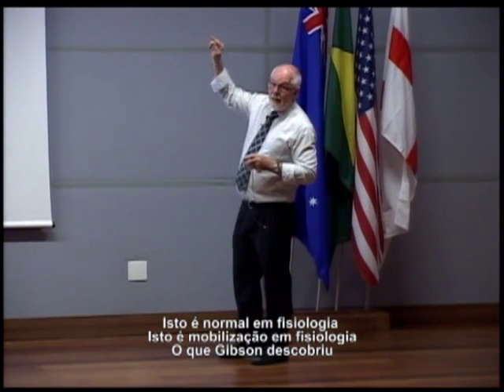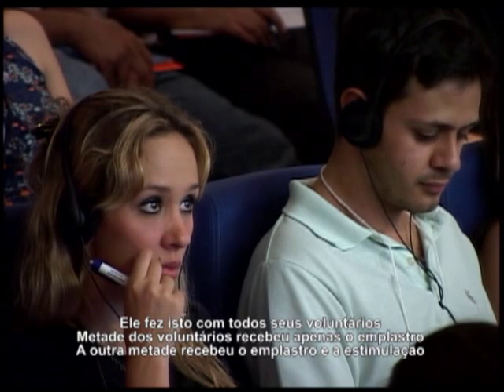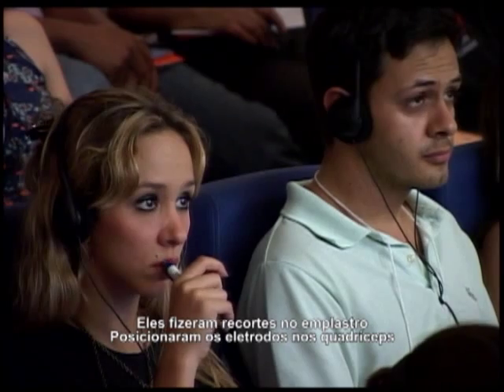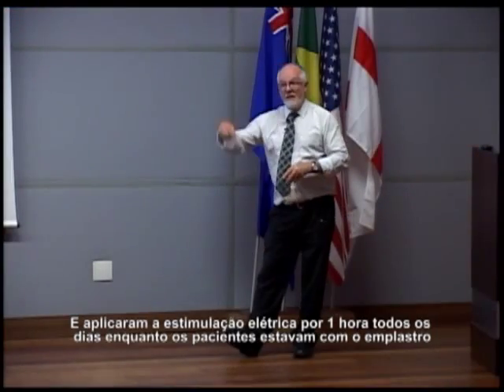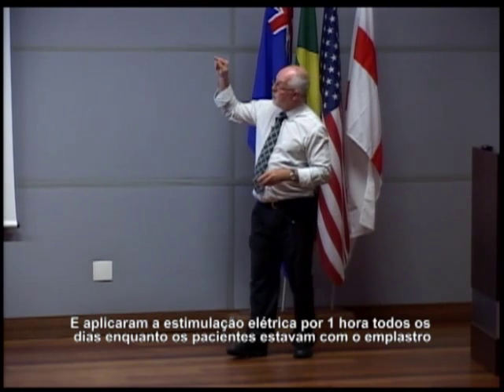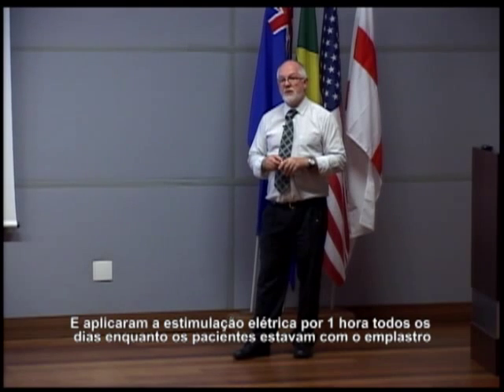What Gibson found was that he did this to all his volunteers. Half of the volunteers just had plaster. Half of the volunteers had plaster and electrical stim. They cut windows in the plaster, they put the electrodes onto the quads, and they did electrical stim for 1 hour every day while the patient was in plaster.